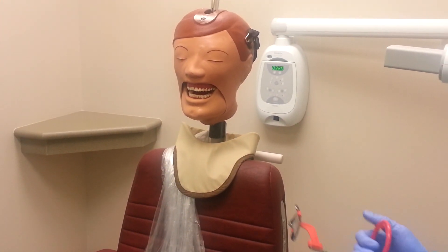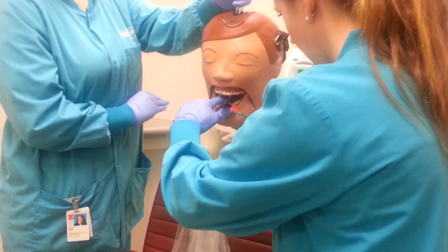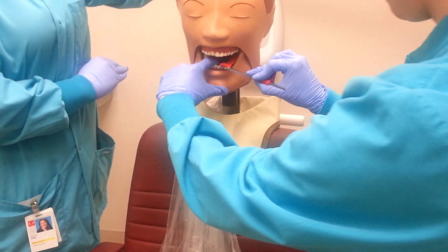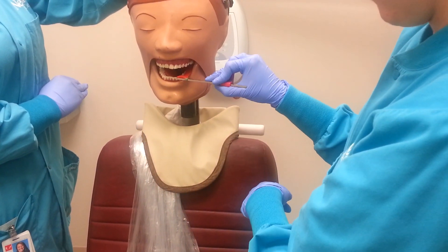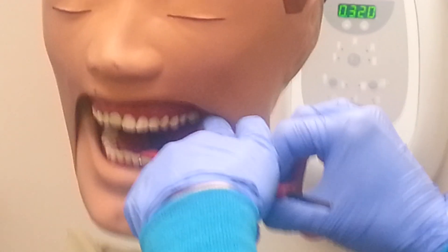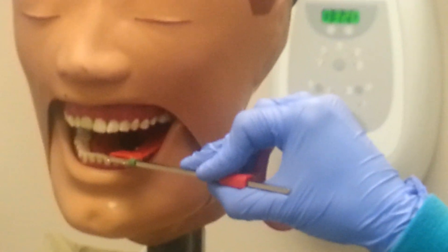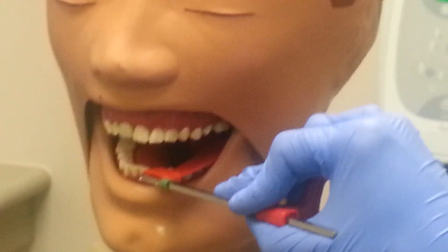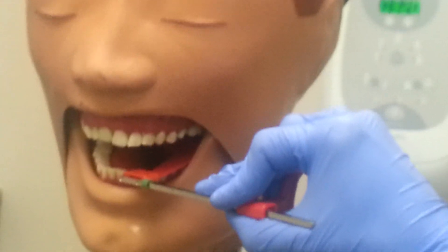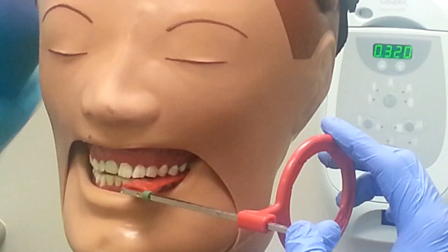When placing the film in the patient's mouth, have them open wide, being careful to avoid their tongue. The film should be placed far enough back to capture 2mm of bone distal to the last molar, but not so far back as to cause patient discomfort. For the molar bitewing, it is important to open the contact between the maxillary first and second molar — avoid causing any overlap of these teeth on the image. Position the bite block so that the line is parallel between the contacts of these teeth. Once the phosphor plate with the XCP instrument is positioned properly, have the patient slowly bite down fully to secure the instrument.